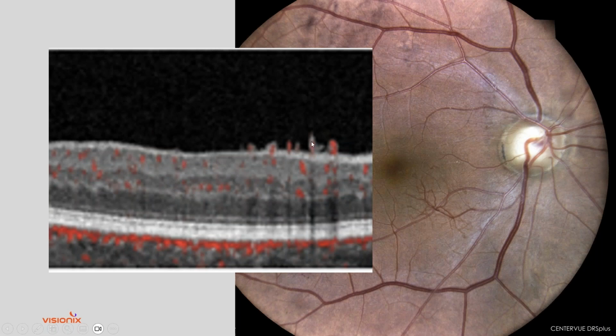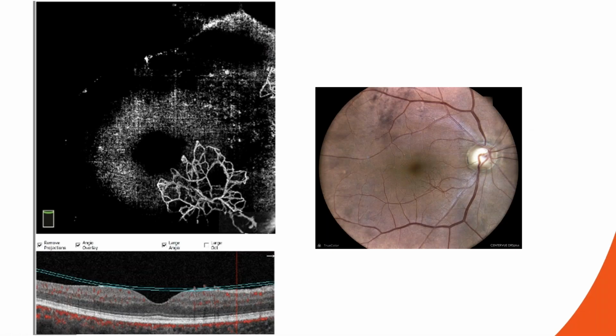The OCT-B scan is highlighting that you've got these little buds of neovascularization. Remember that whenever there's pixelation, you have blood flow running through this. So guess what? This is neovascularization. I mean, who would have thought in a quiet retina?